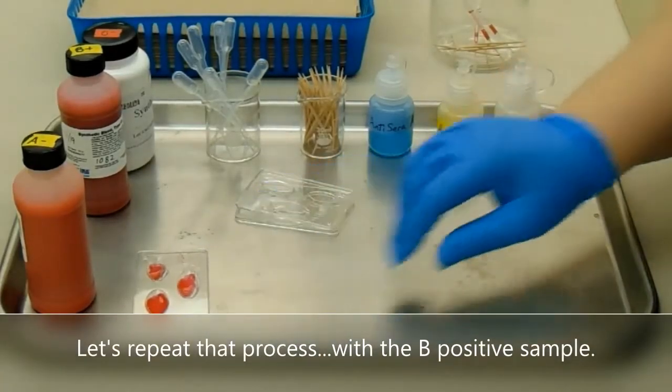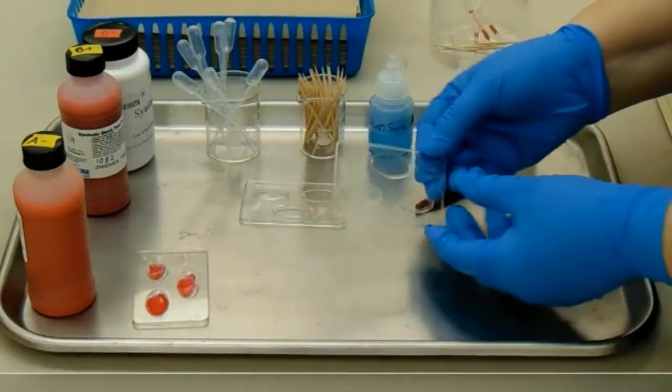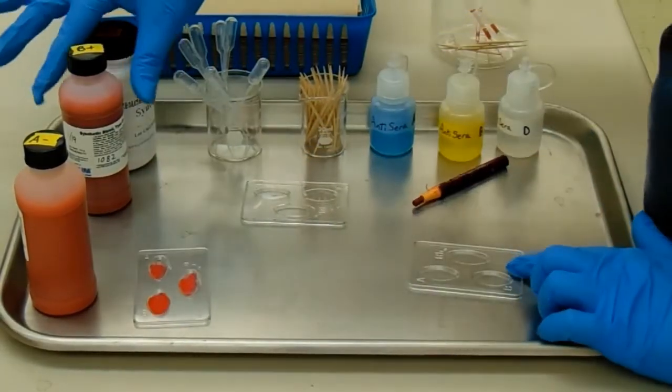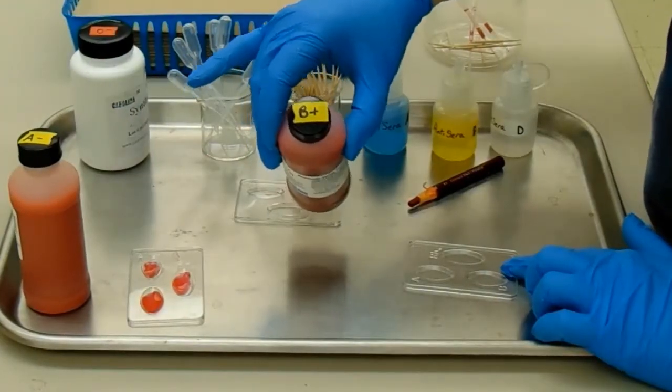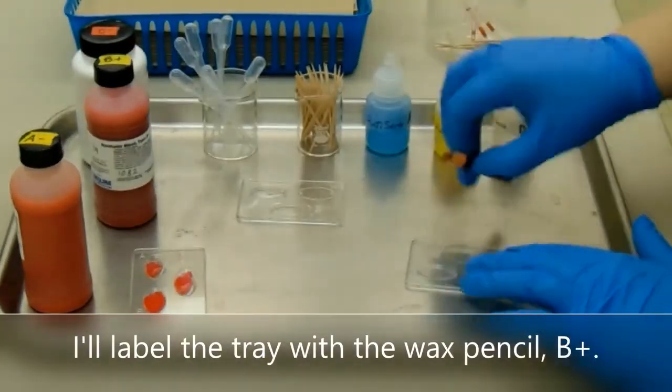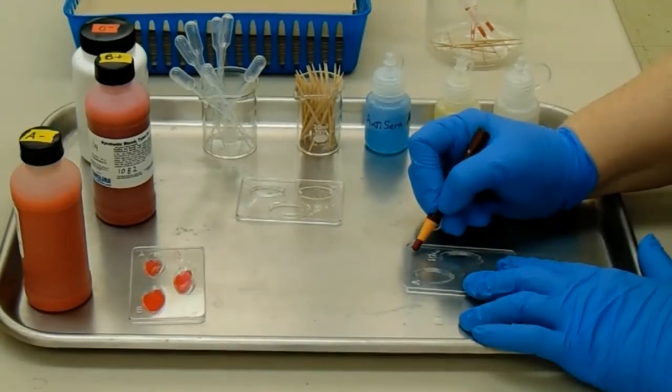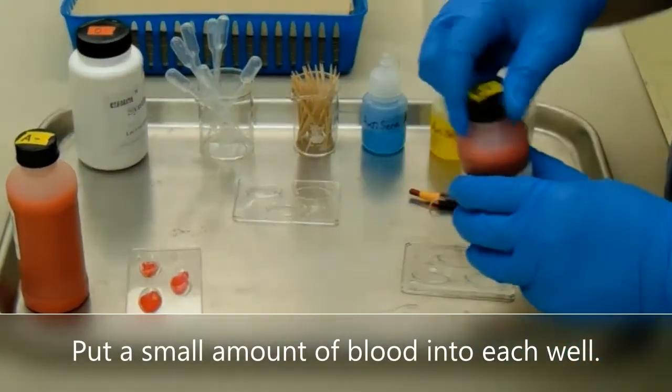Let's repeat that process with the B positive sample. I'll label the tray with the wax pencil B+. Put a small amount of blood into each well.